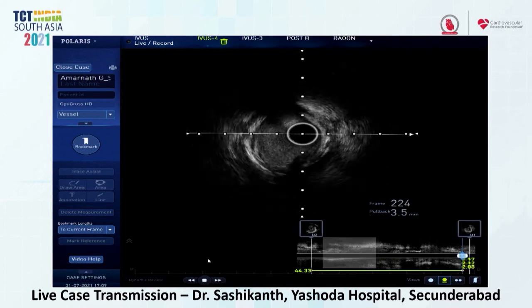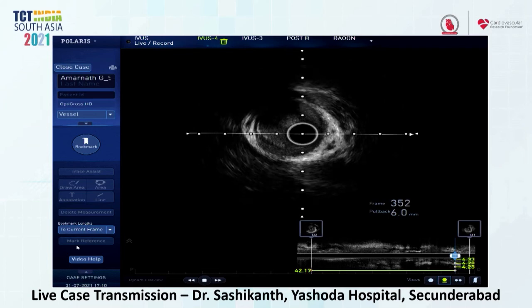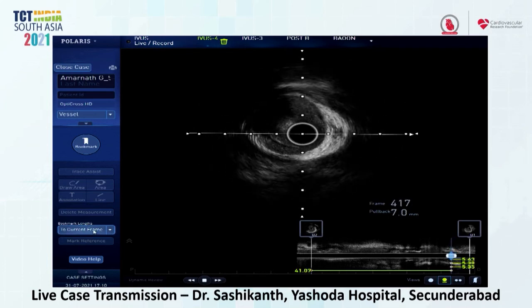Aditya, Dr. Aditya? Yeah, so we have the catheter parked in beyond the lesion. Can you be a little louder?